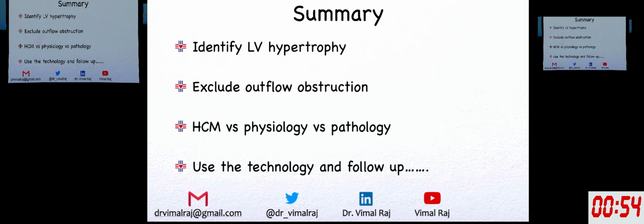Physiological, hypertensive, high altitude, or a professional athlete. Then you have to go and look at the pathological causes. Look at the LGE, use the technology, look at T1 mapping, and you will be able to then differentiate a lot of pathologies. Absence of SAM, absence of LGE does not exclude HCM.